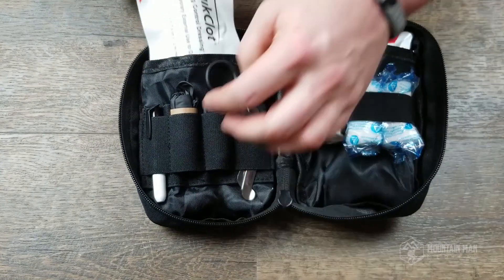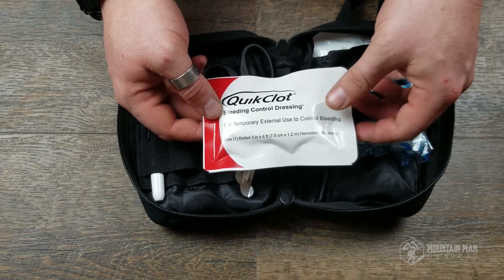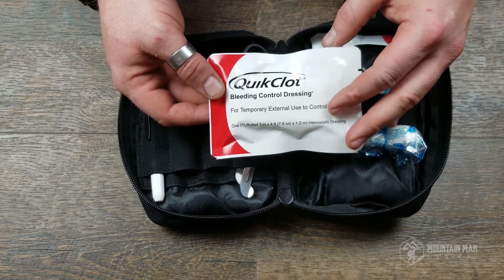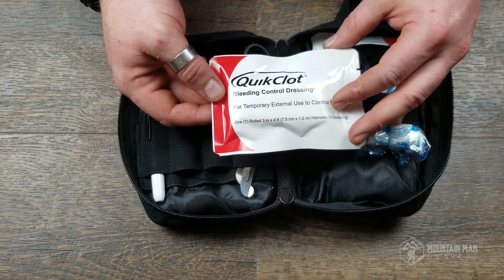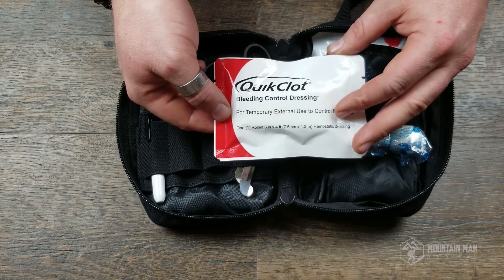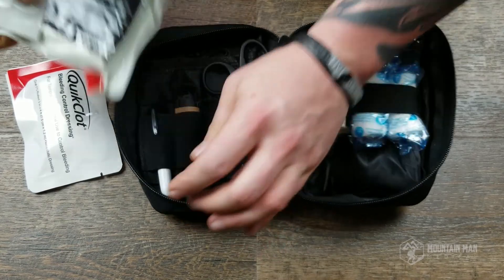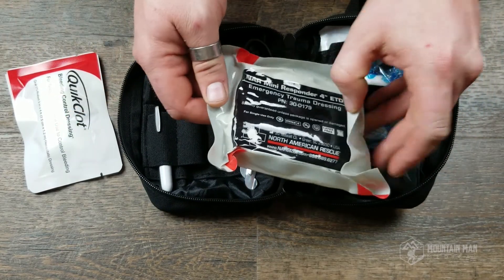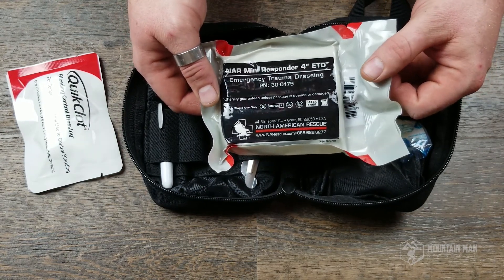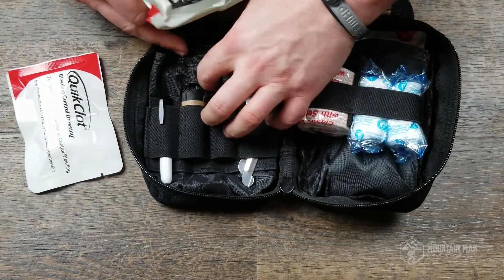Behind that we've got QuikClot gauze. I have personally used this product with great success. QuikClot is a well-known brand — it's a hemostatic agent that makes the blood clot more quickly, and it works. Behind that we have our North American Rescue pressure bandage. North American Rescue is a high-quality, well-known company. I used a lot of their products in the military, and this comes in nice flat packaging so that your kit isn't too oversized.